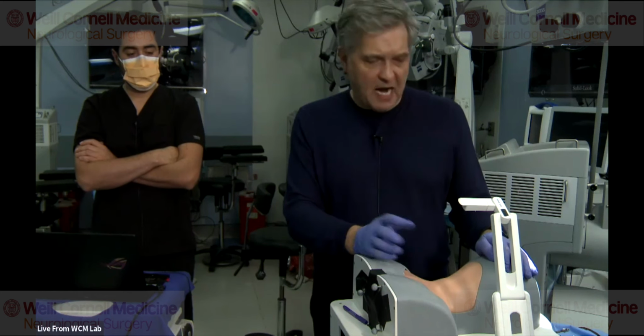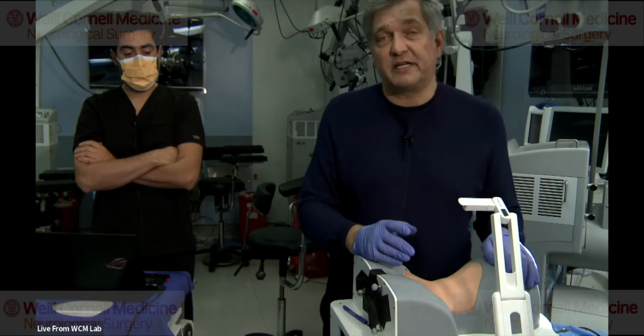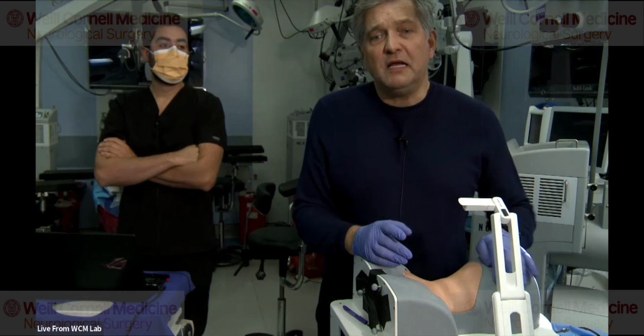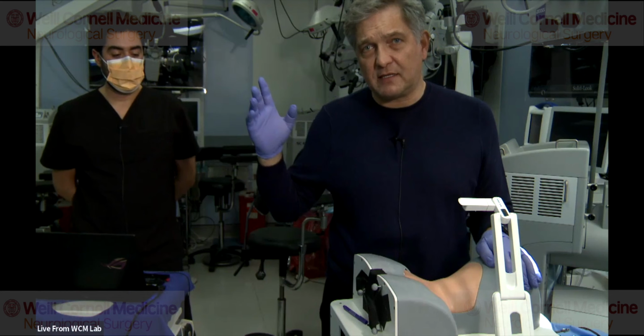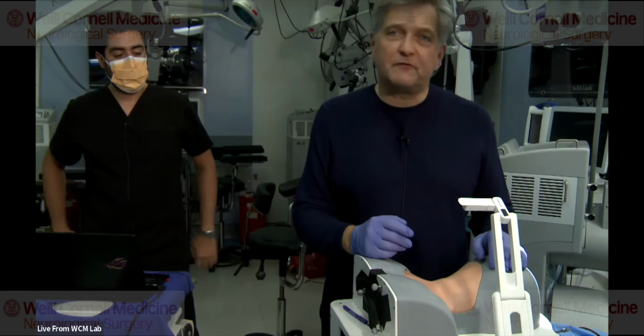Now, in this particular case, or in any cervical foraminotomy case really these days, I like to use navigation for the localization of the pathology. Of course, you can do this with fluoroscopy, and that's certainly something that I do as well. But I found that if you have navigation available, especially if you're looking at the lower cervical spine, so C6, C7, T1, where fluoroscopy sometimes can be a little bit challenging.